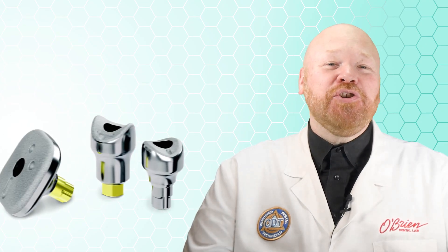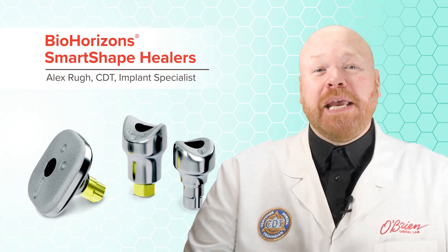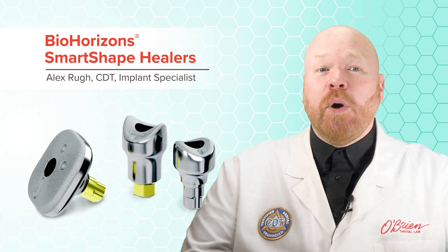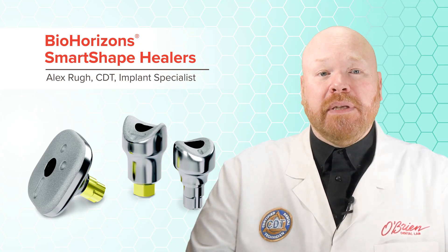Hey everyone, Alex from O'Brien here. In this video, I want to show you a really great product from BioHorizons called the SmartShape Healer. The SmartShape Healers are anatomical healing abutments, which in most cases are going to be a lot more ideal than the traditional cylindrical healing abutments.